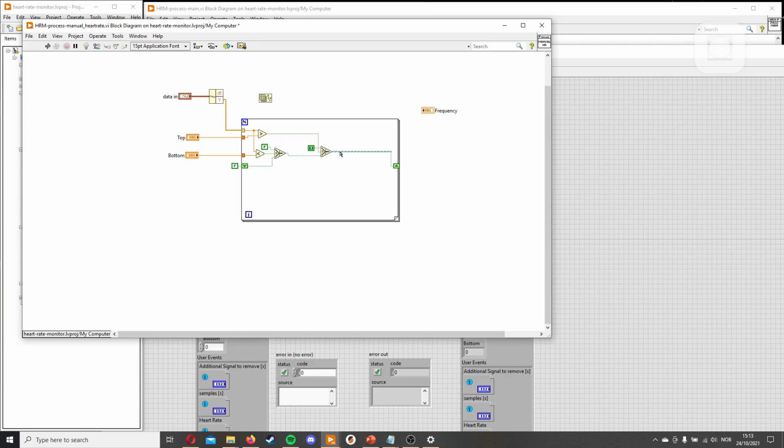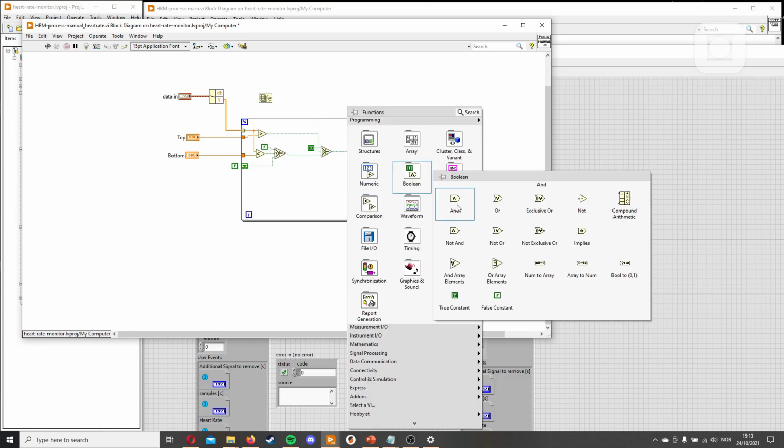But we need some way of counting the toggles, because we don't want just one toggle. We want to have every time it flips from low to high. A way to do this is to say if the last value was low, but it's now high, that means a heartbeat, or like it has a trigger. Because if this value is high and this is high, it means it has stayed over the value or not yet past the bottom value. And if this is low and this is low, it means that it has stayed below the top value both last and this time. The way to measure this would be to take an AND loop.